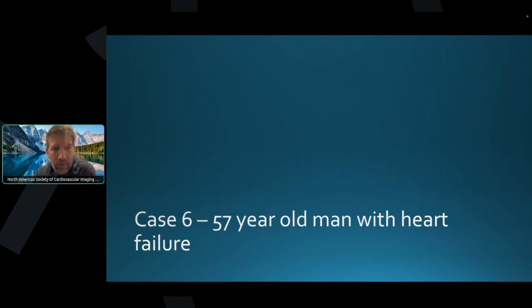That's a good question. I don't know. It depends on the type of the defect. The first one I showed, it's like a weird channel where you have almost like a flap of that. So you can measure the defect where the channel ends, but everything else is going to be pretty friable and thin tissue. So that's not going to hold a device for sure. It would have to be a more well-formed defect with thicker walls to support a device, in my opinion.